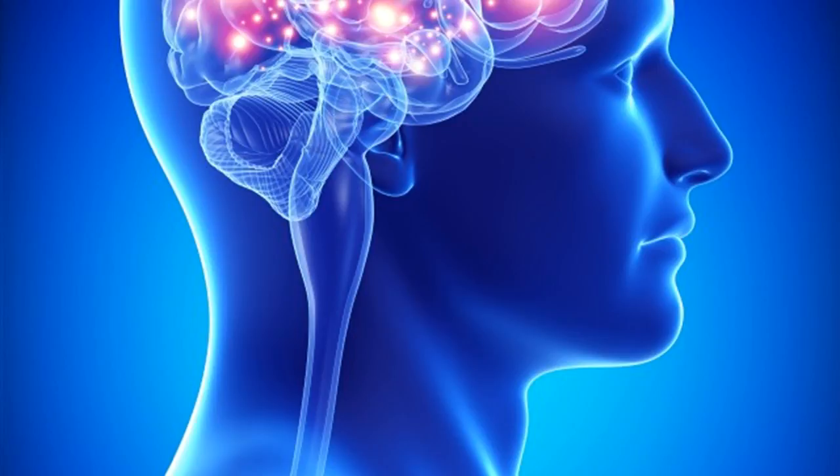The idea is that when a part of your brain is stimulated and jumps into action, the body sends extra blood to that part of the brain to support that action. fMRI scans the brain without potentially harmful X-rays, and it detects this increased flow of blood, which shows up on a computer monitor, and you can actually see which parts of the brain have become more active.